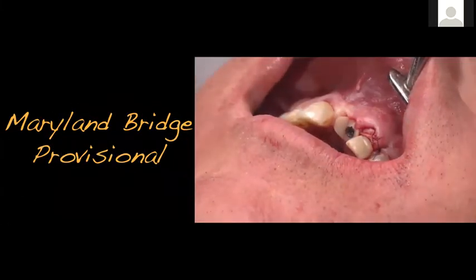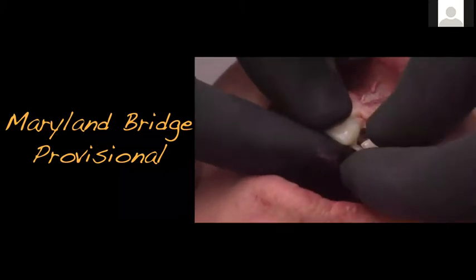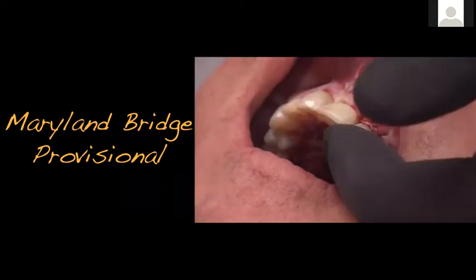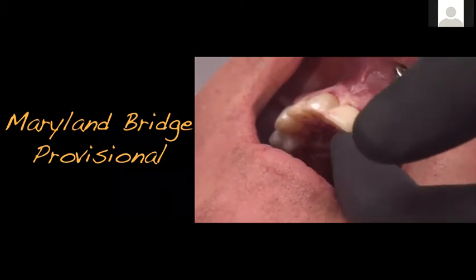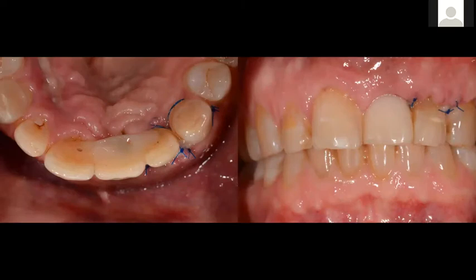And here's the Maryland bridge that Mike had prefabricated, pre-milled preoperatively. It just goes on top of that area and gets bonded into place, sitting right on top of that custom tissue former, and thereby we're still providing the patient with a fixed restoration. Here it is in the palatal view. You can see it here, bonded in place, and here it is right after the procedure.